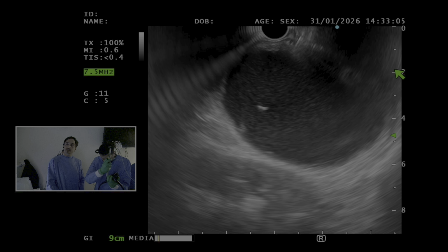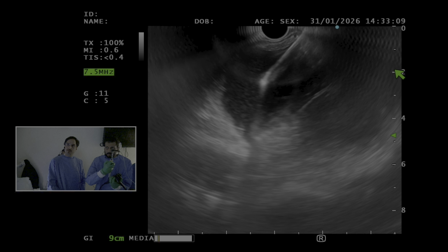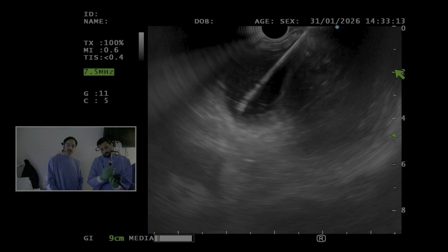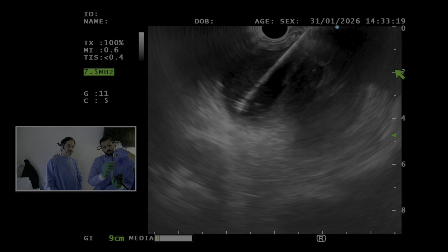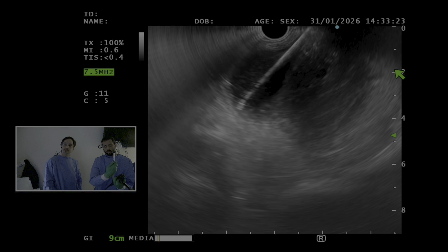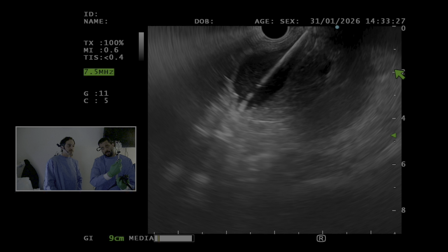So we're using the Axios stent, 10 millimeter, just because it's a smaller cyst. So Saad is in. So this is the first step. The catheter is in. He's going to deploy the inner flange now inside. Remove the cautery, please. So always good to remove the cautery. So I usually go deep into the cyst, and then after that, I unlock my distal flange.